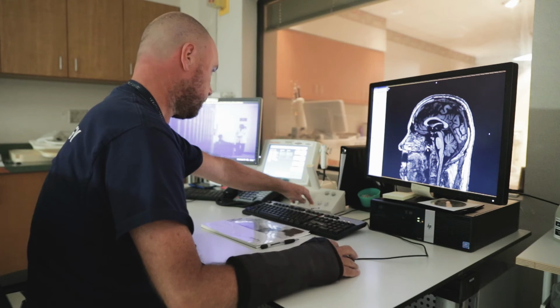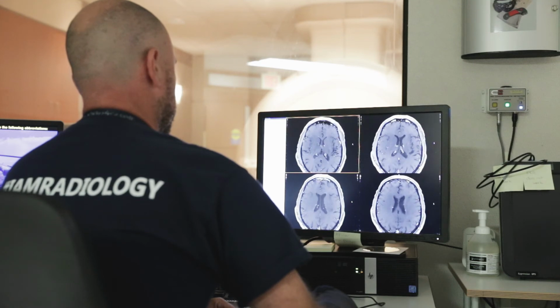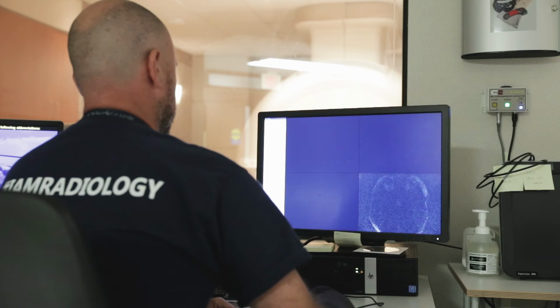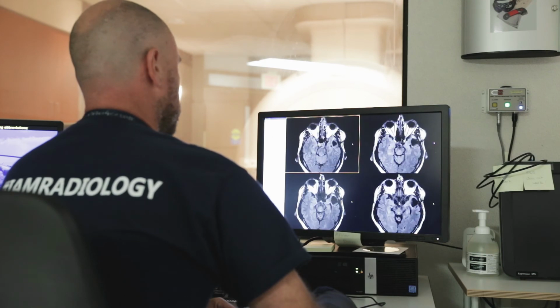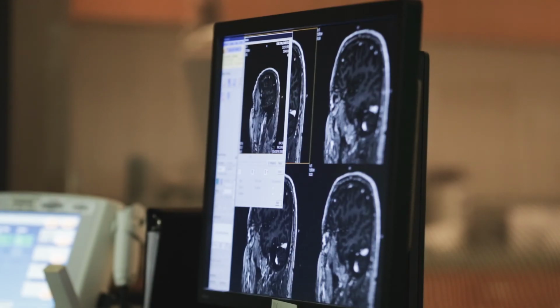If your scan is a functional MRI, the technologist will ask you to perform some small tasks like moving your fingers or answering simple questions. This helps to locate the parts of the brain that are used during these tasks. An MRI test can take 30 to 60 minutes to complete for each part of your body being scanned. During the scan, you will need to hold very still because movements can blur the images.